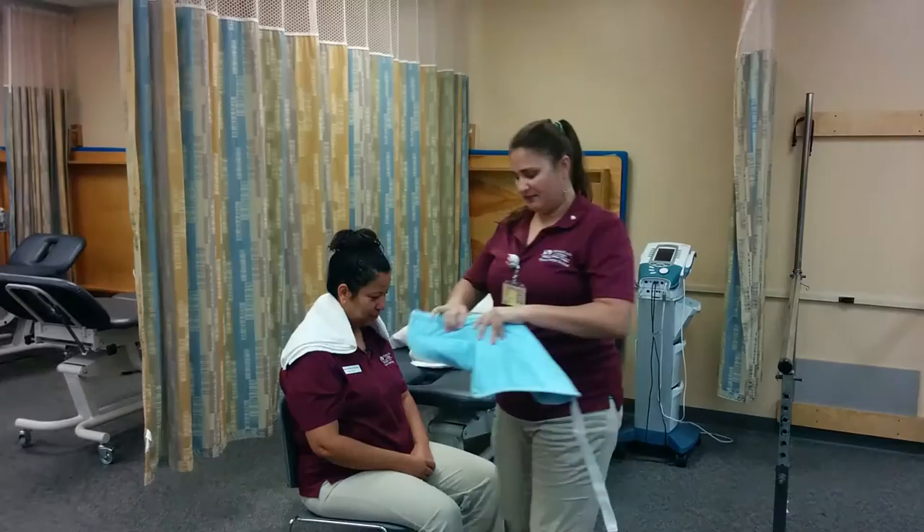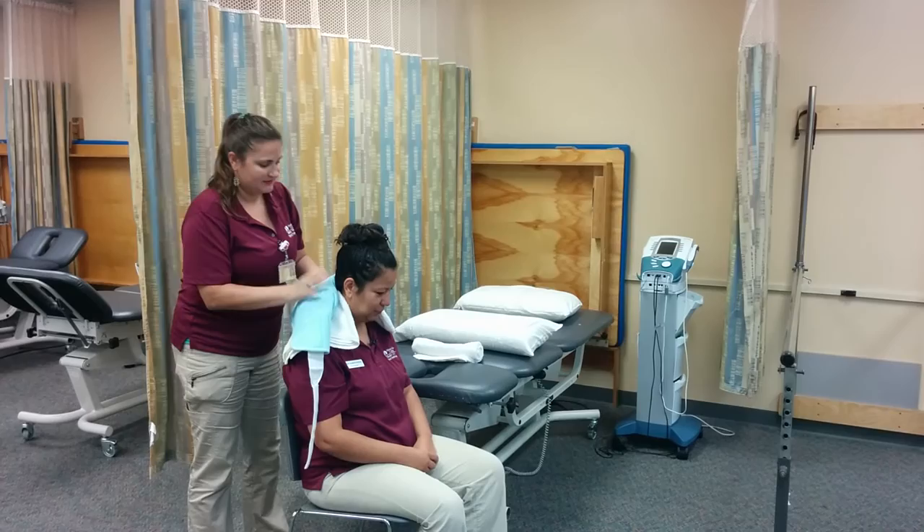And I'm going to apply this hot pack right here. Let me know if that feels okay. You good there? Everything doing good? All right.